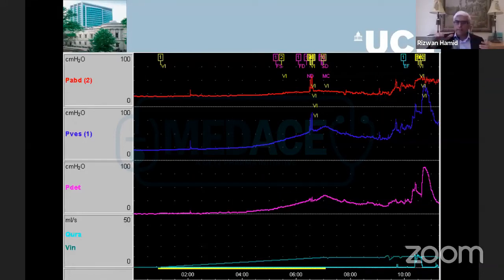So when you stop, it comes down and you fill slowly and it stays down. That is why Shahzad alluded to that it is very important to do a frequency volume chart before you do the urodynamics, so you see what the functional capacity is. So if somebody's got a capacity of 150 and you start filling them up at a speed of 100 mils per minute, after a minute, they will have loss of compliance.